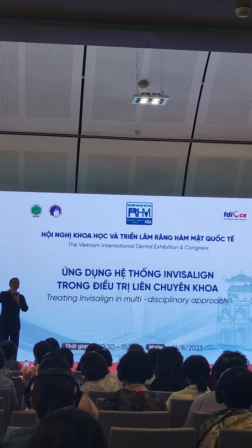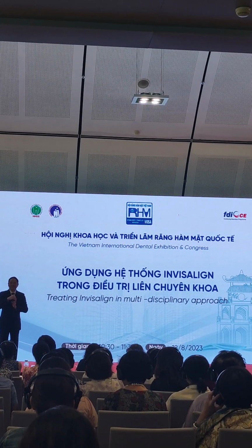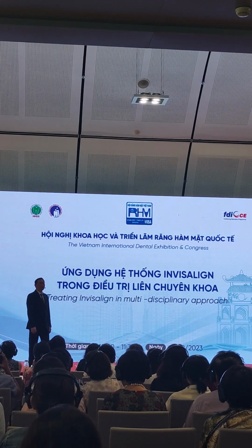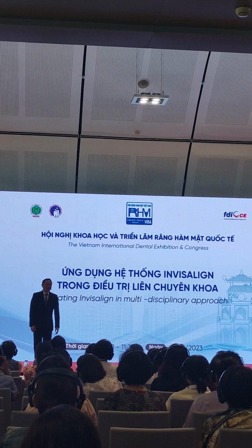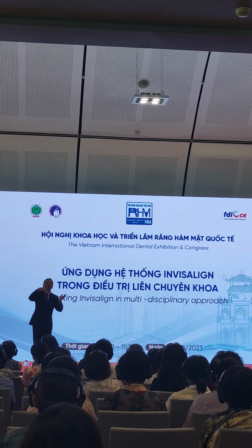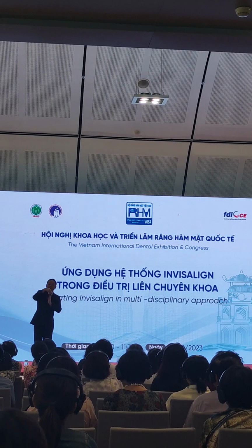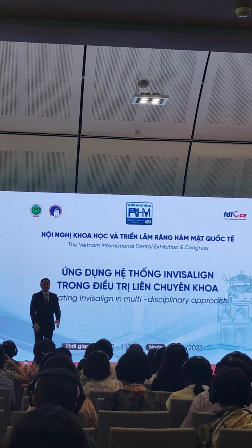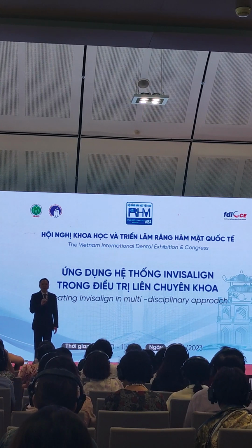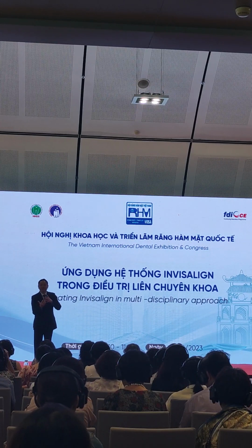Okay, you mean the upper and lower teeth overlap is about the anterior. Will it produce a premature contact? Yes, it will. Because when you align with aligners, you always see premature contact and posterior open bite. It happens. No matter whether you are doing an ordinary class 2 case or you need to jump the bite for a class 3 patient to correct the anterior crossbite. This is unavoidable. But the good thing I want to tell you is, usually this premature contact won't turn into a traumatic occlusion. So you just need to accept it and do things quickly.